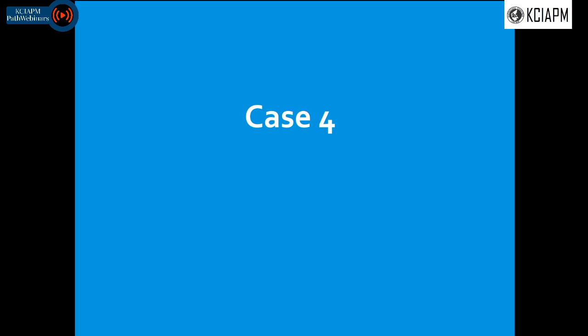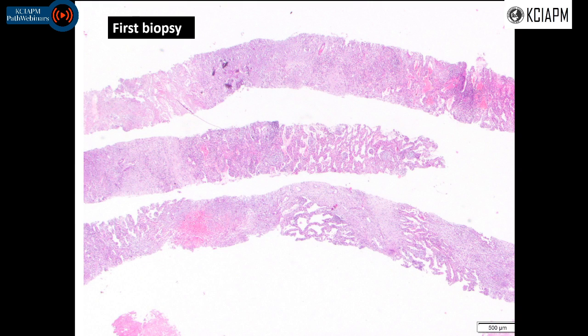So we move on to another case, a case for opinion. It was a slide from a 52-year-old female. It was a lung biopsy. The patient has a big patch in the right upper lobe, and two biopsies were sent.